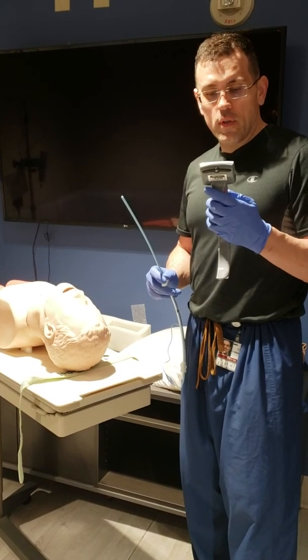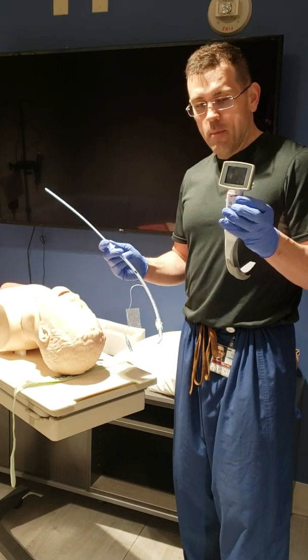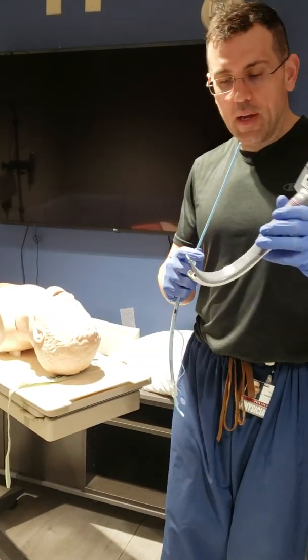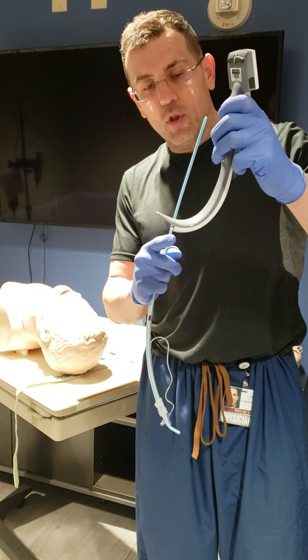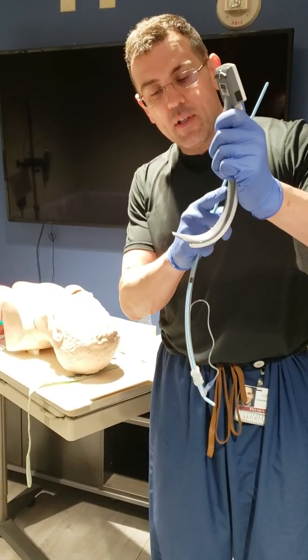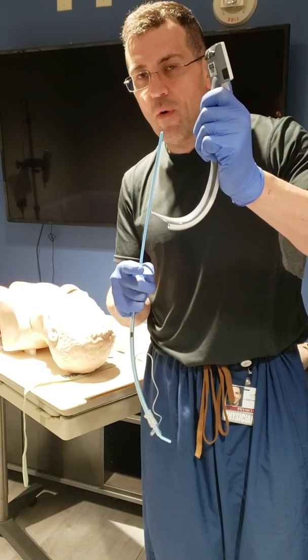Today we're going to go over how to use a King Vision — this is a number three. One of the first things to notice is how curved the King Vision is. Like all video scopes, you're meant to see the glottic opening with the camera. But since it's so curved, it's going to be really hard, if not impossible, to get a direct vision.